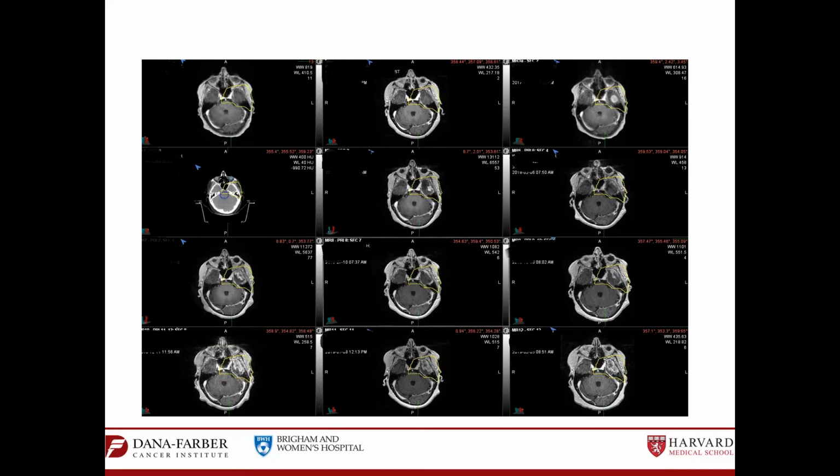That's why I'm saying do not do SRS after SRS. If you want to do that in special cases, for example a patient who refused surgery, that's why we have to re-irradiate. So when we decide to re-irradiate, we do fractionated 30 gray in 5 to have a gentler dose. And even with that, with the serial MRI coming back, she started to have another area of enhancement.